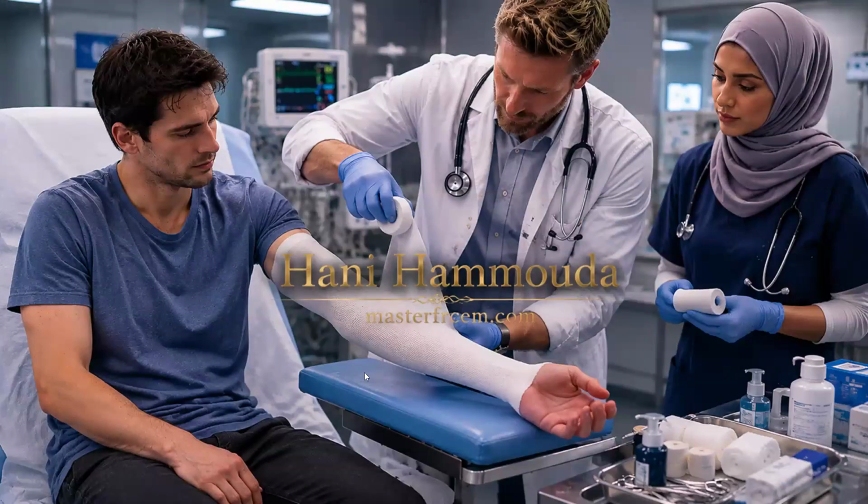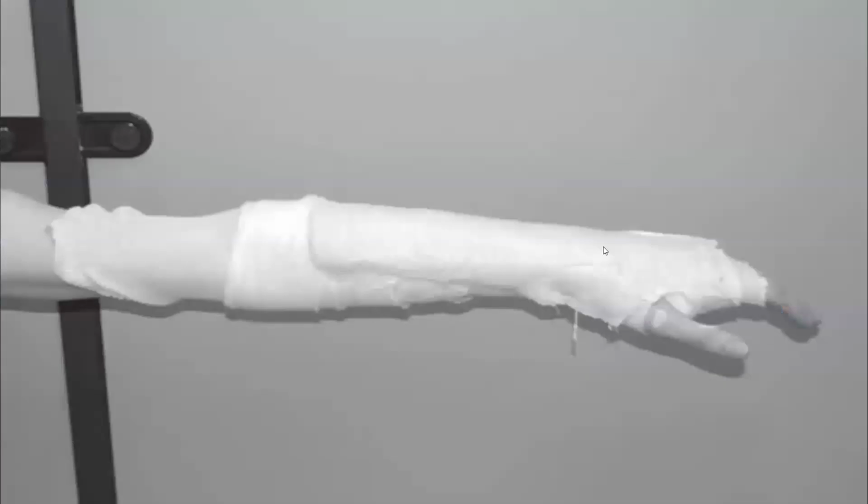Okay, so the most important thing is to verbalize. I will apply cotton pad from the elbow to the metacarpophalangeal joints. Then the plaster bandage, 6 layers or 8 layers, it's up to you in the exam. You will measure 1 layer, put it on the table and repeat. Then once you cut, put it in the water and on the patient. If you are not perfect, for example, you put it here, don't worry. The most important thing is to verbalize. Okay?